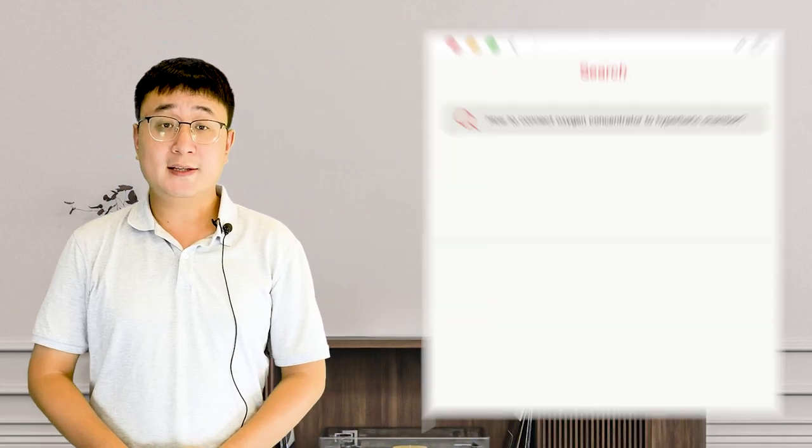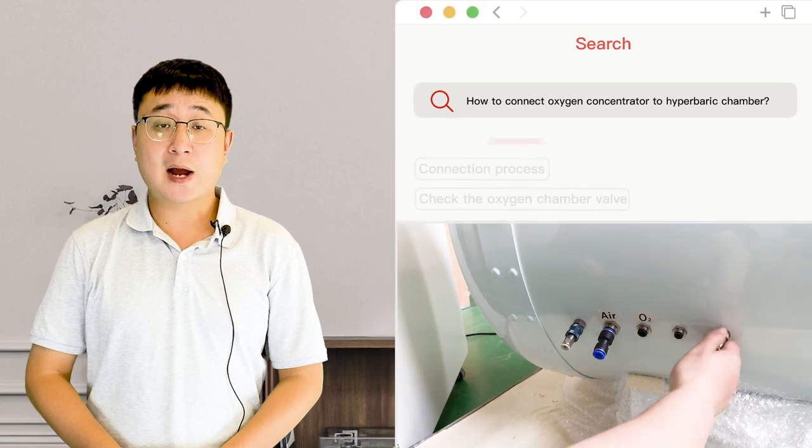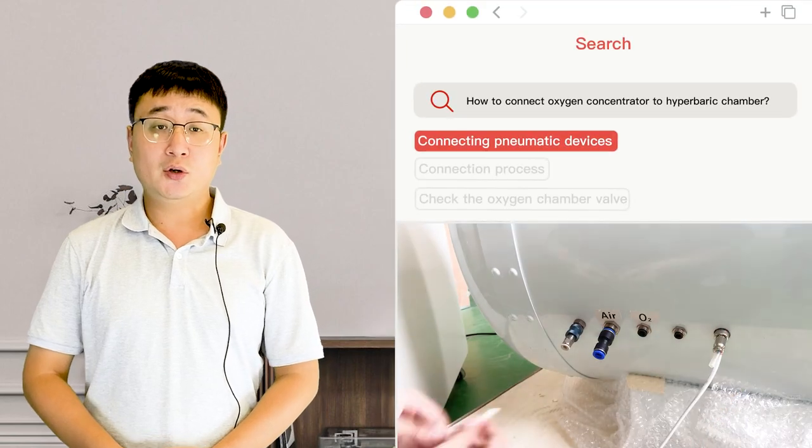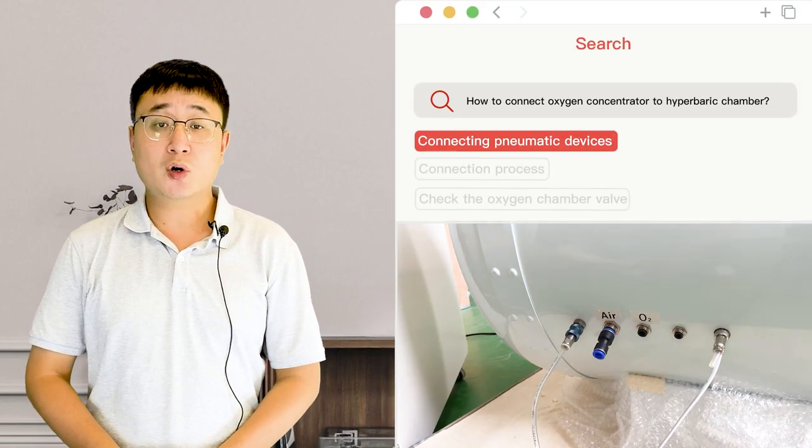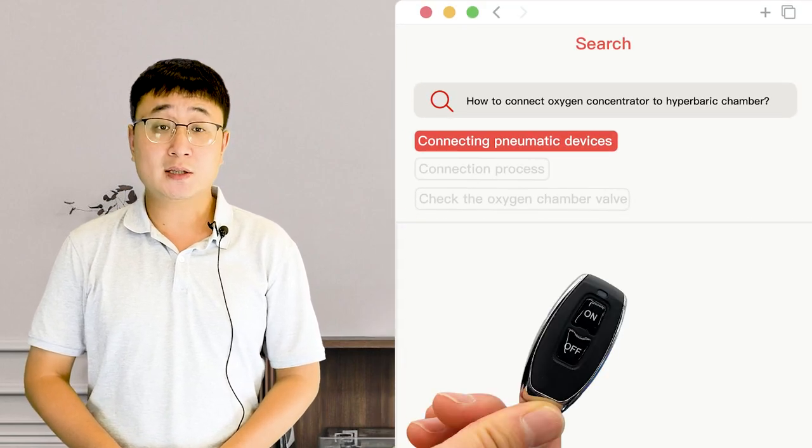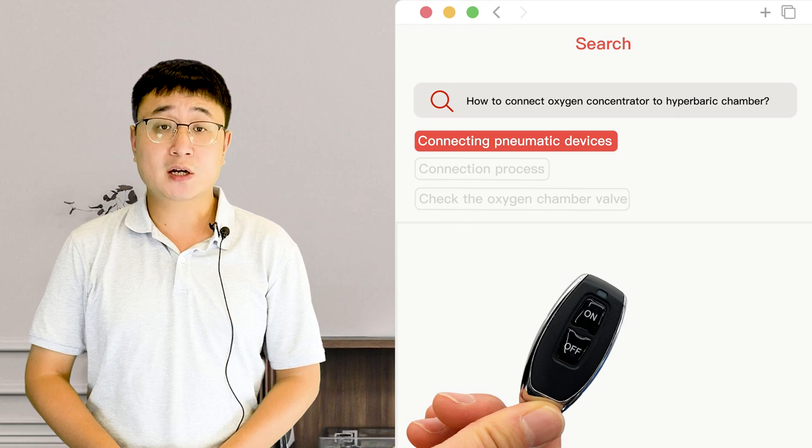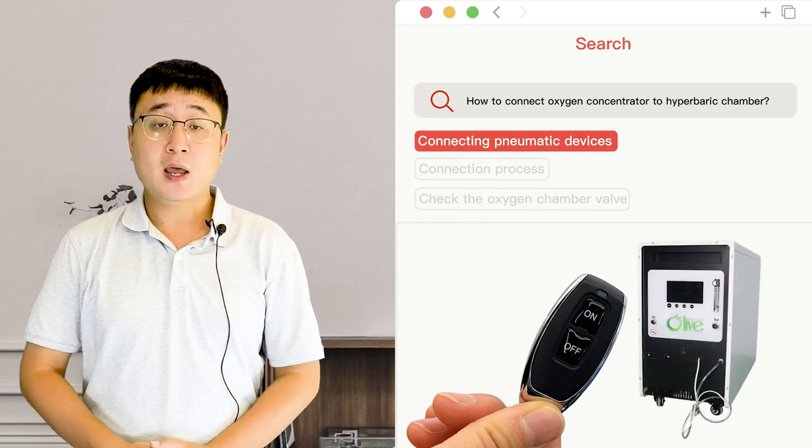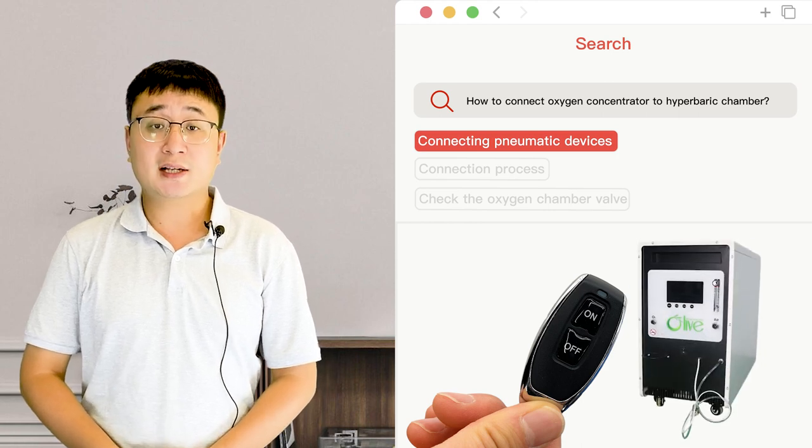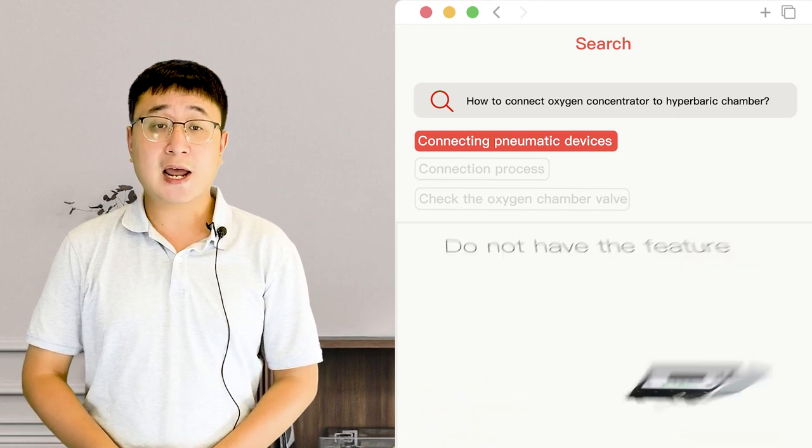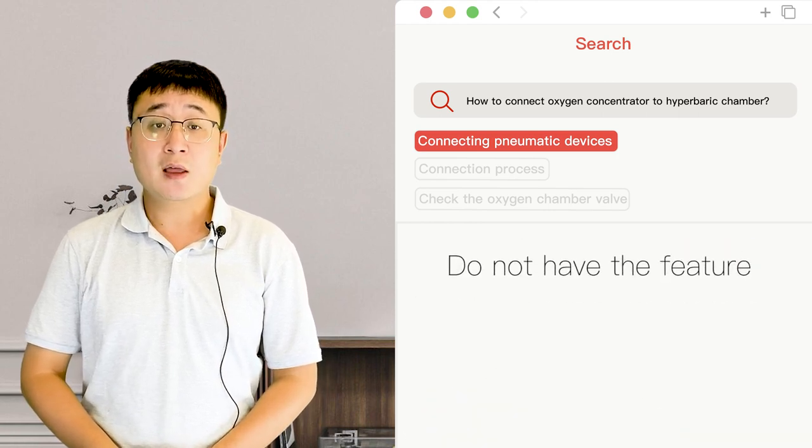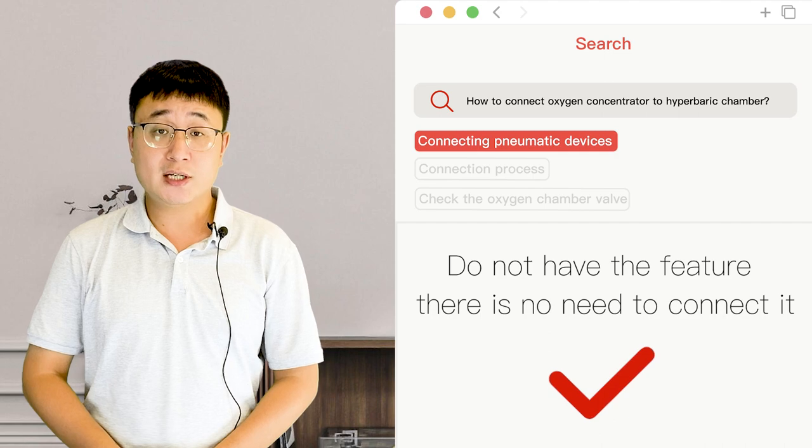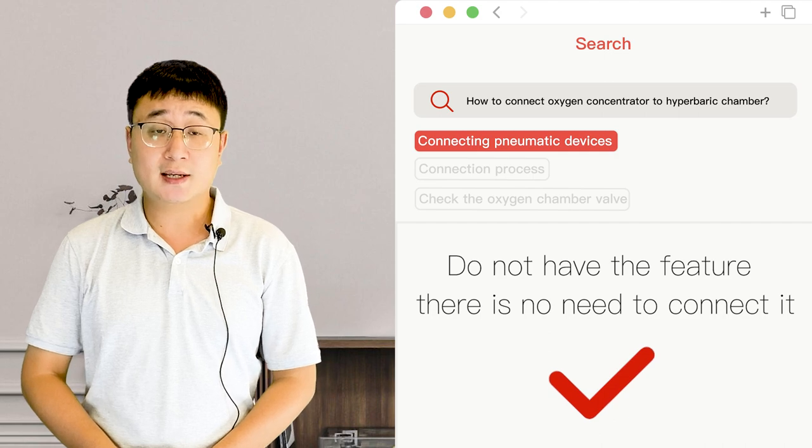Connect pneumatic devices to use a remote control to control the operation of the oxygen concentrator. If your product does not have this feature, there is no need to connect it.